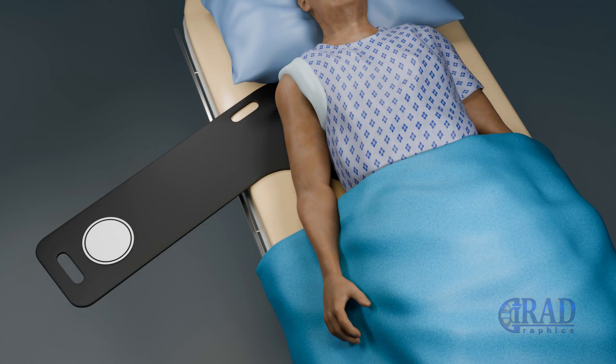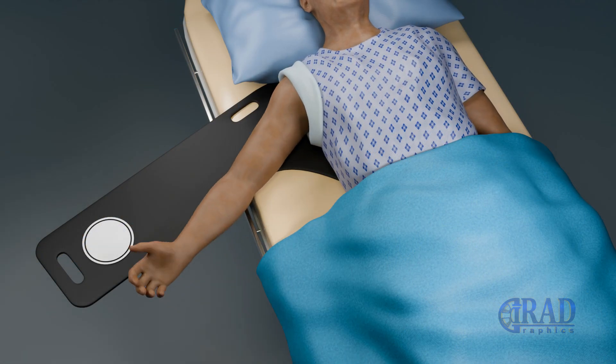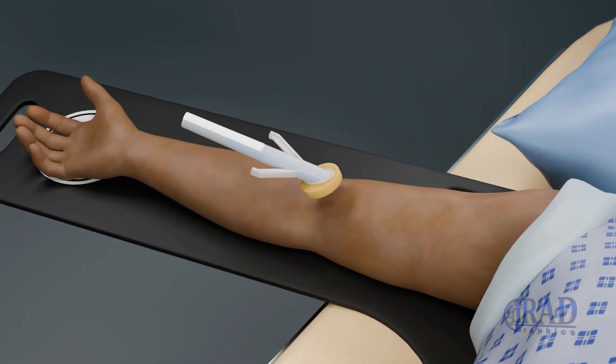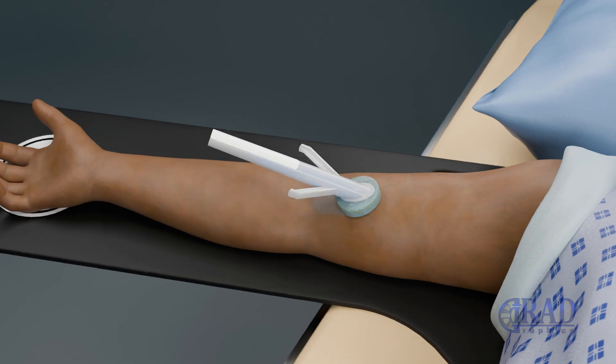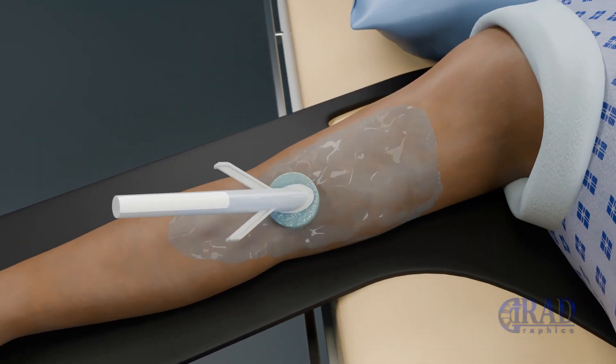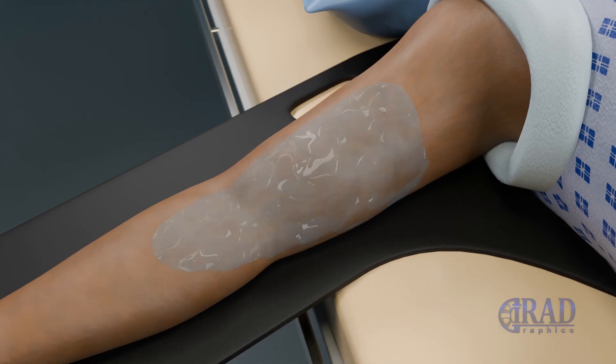The patient is positioned supine on the procedure table with the target arm extended to the side to facilitate venous access. The skin is thoroughly sterilized in the antecubital fossa and upper arm and then draped in a sterile field to reduce the risk of infection.